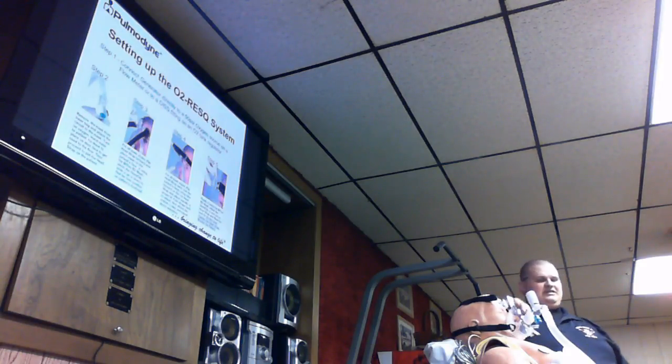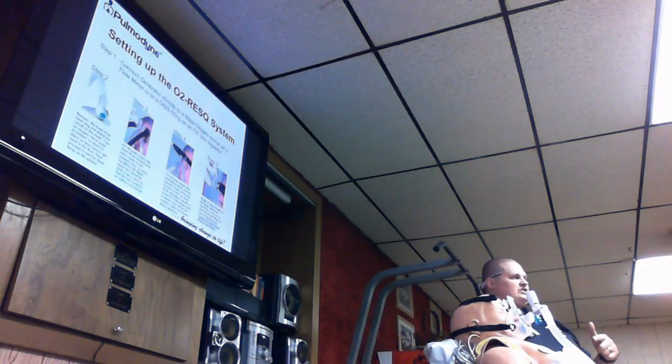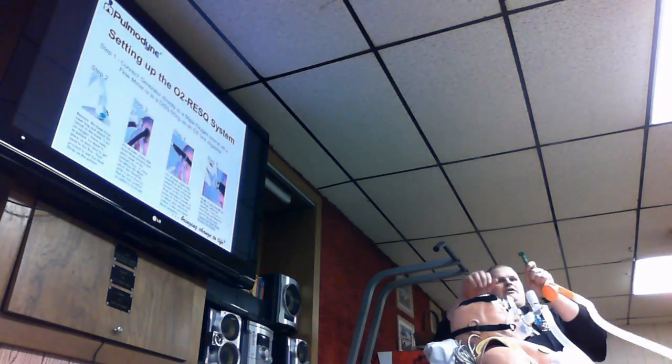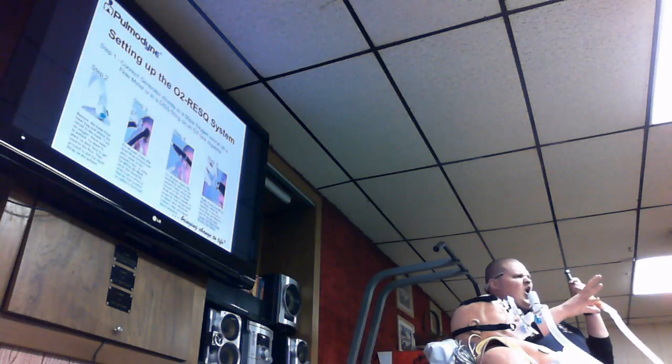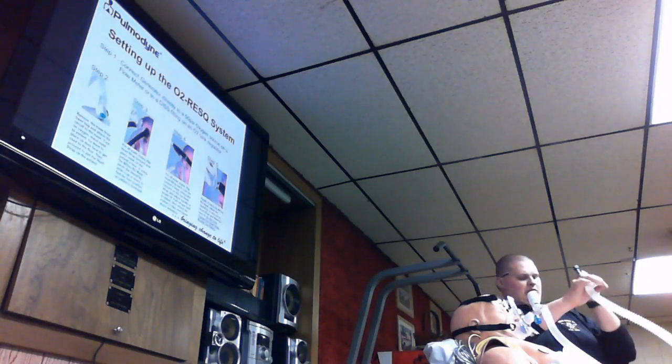A lot of times you want to get these on your patient, then ask them 100 questions. Well, you can't really talk, because when you hook this up right here to the end of your O2 tank, this makes a horribly loud noise. It's going to be like a high-pitched scream, okay?